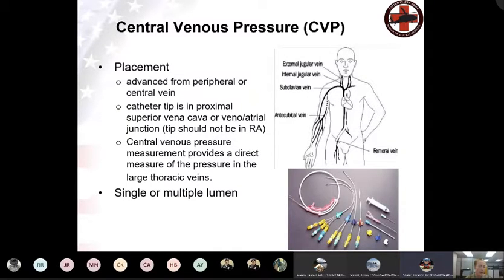I love that. Now, Captain Wang, can you tell me what is the unique feature that makes a central line be categorized as such? The placement of it, like the fact that a central line goes all the way up and follows directly all the way and sits. Keep talking it out. Kind of like at the top of the atrial valve, the top. I'm going to help you out. It's right at the top of the atrium.